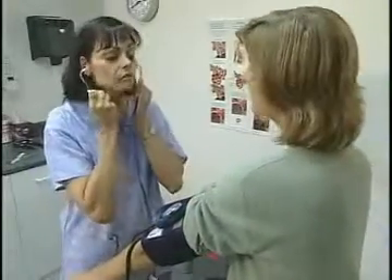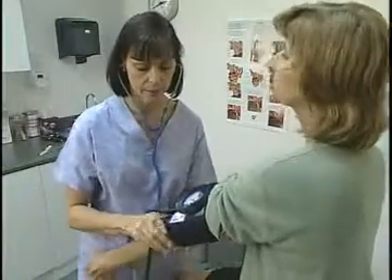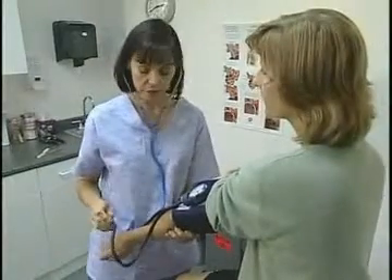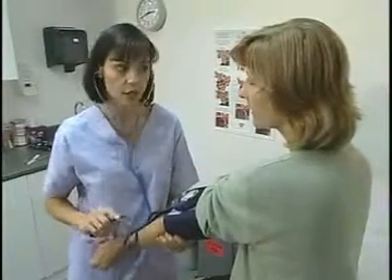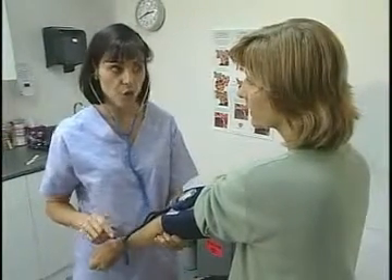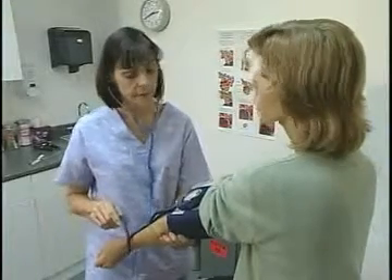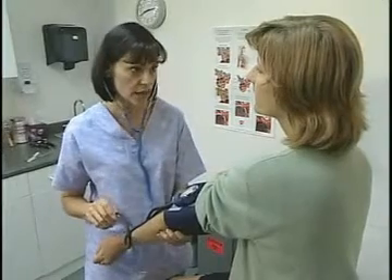Well, right now I'm looking for your artery to be able to hear your heart beating. This screw allows some air to escape from the valve. As the cuff deflates, I'll be listening to hear the first sound of your heart beating and note the pressure at which this occurs. That'll be your systolic pressure. Then I'll wait till I hear no sound at all. That's your diastolic pressure.